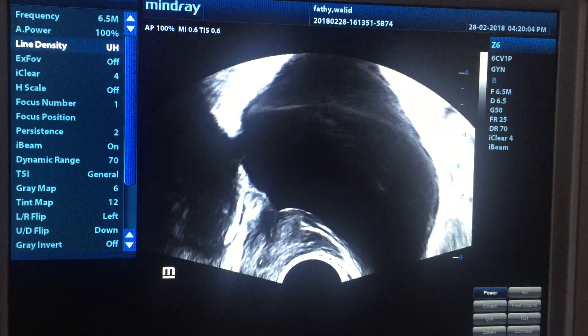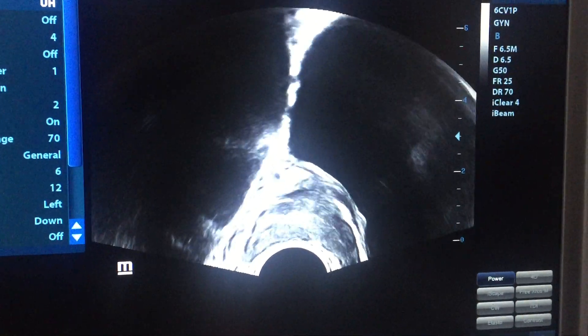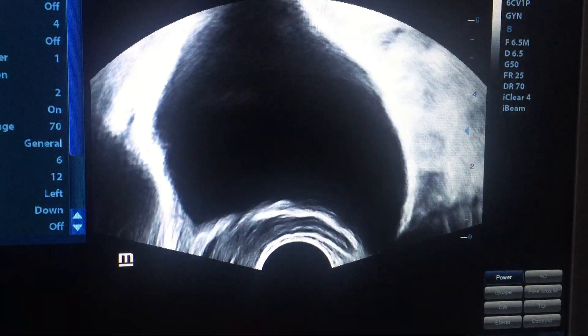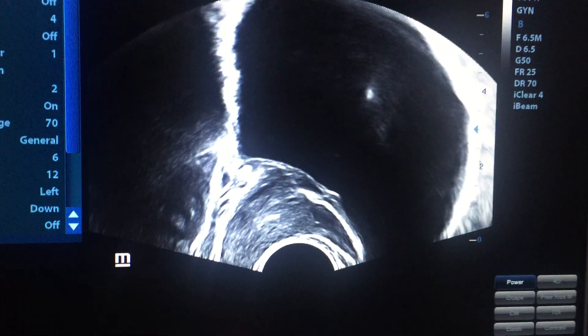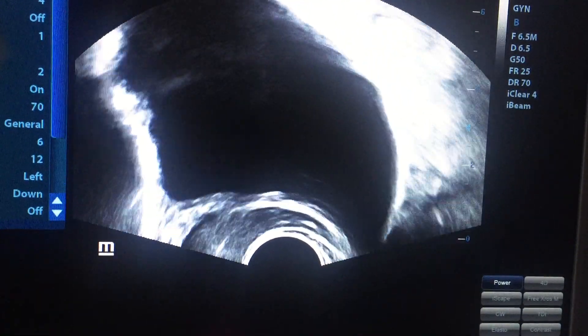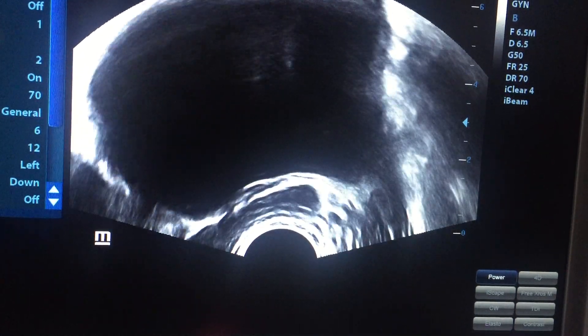Now we will explain how to do transrectal ultrasonography. After introducing the probe, the bladder is a little bit full with urine, which should not be like that — it should be semi-full. We will start first with a transverse study.